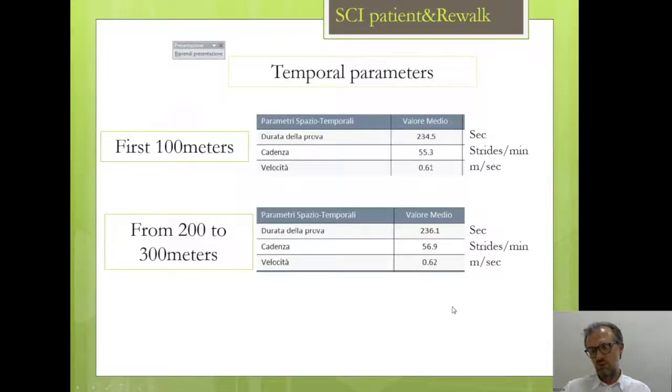of the evaluation. And this is an objective way to get data about the ability of the patient in maintaining the same standardized task exercise while he's using the exoskeleton. This is important, particularly if you want to provide an objective evaluation about the possibility to prescribe the exoskeleton even while the patient is discharged from the hospital and has to go back home.